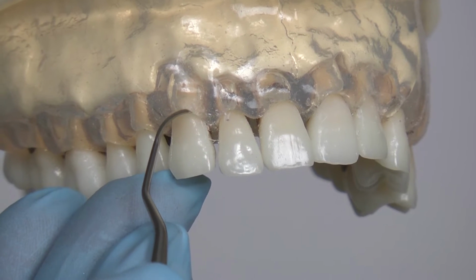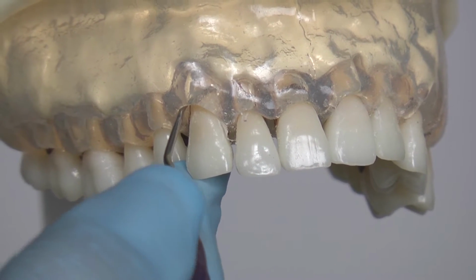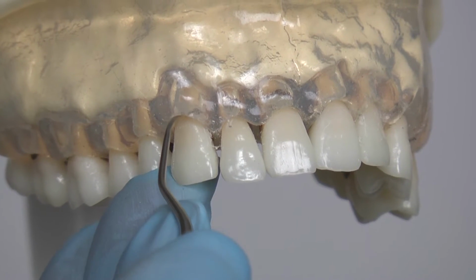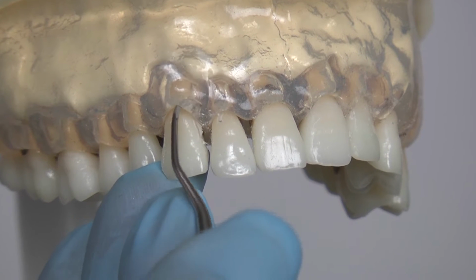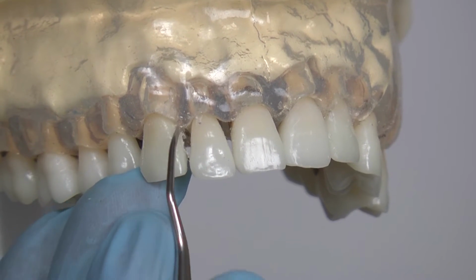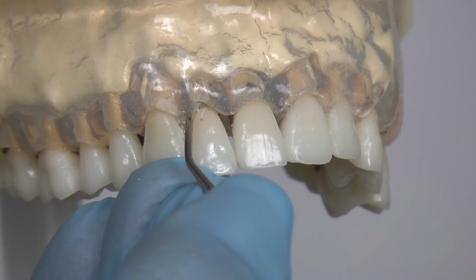When applied to each of the anterior teeth, the Gracey 1-2 curette is inserted at a 0 to 40 degree angle and opened to 70 to 75 degrees at the midline on either buccal or lingual surfaces and activated using overlapping stroke patterns from midline to the proximal surfaces.